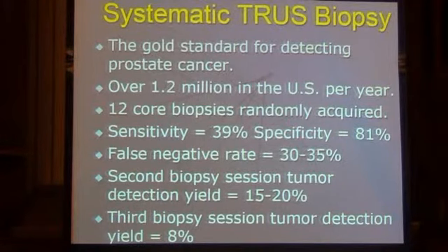Because that means that it's somewhere where you're not going to get it with TRUS, and it's more difficult to get, and you've also done some damage to the gland already. And raise your hand if you think it's been a comfortable procedure, if it was enjoyable. That's always a 0. I have not had a taker on that yet. So it is a very uncomfortable procedure. Urologists typically do it in their offices, but until recently, this is what they had to try to find this.